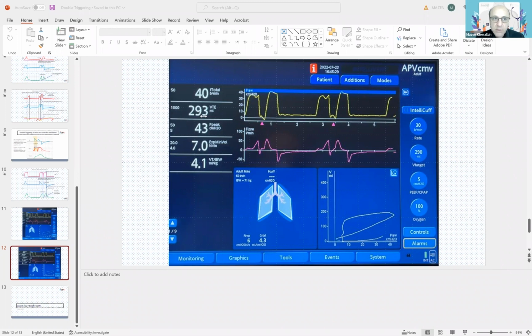If you're not setting the tidal volume appropriately, the patient may be trying to suck more air into the chest. Remember, in volume control mode of ventilation, if the patient is breathing with the ventilator, the pressure on the ventilator will go down in order to get the volume in. However, the patient cannot get more volume than what the ventilator is giving him. So if you set it at 350, for example, and he is actually looking for 500, he would continue his inspiratory effort to try to get that much tidal volume, and it is not allowing him.